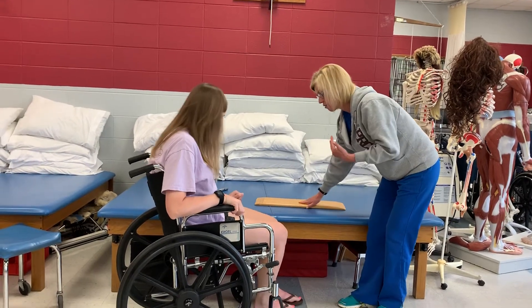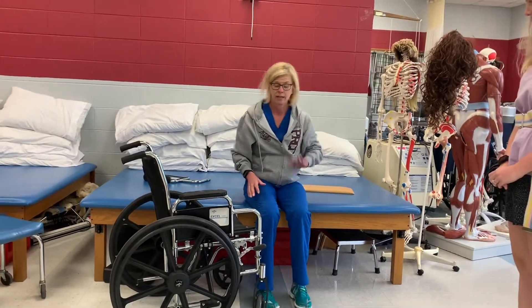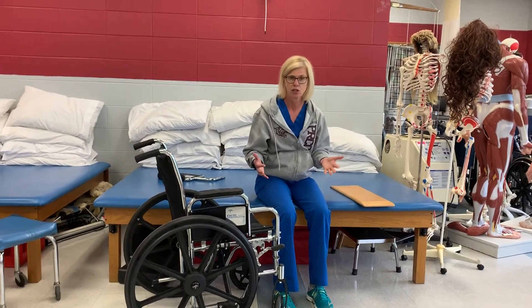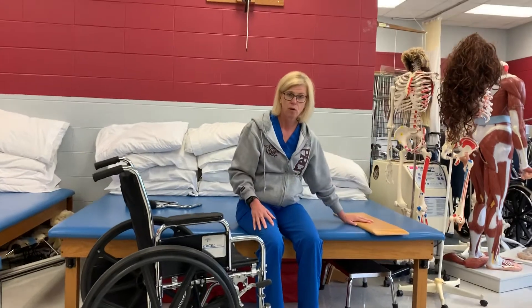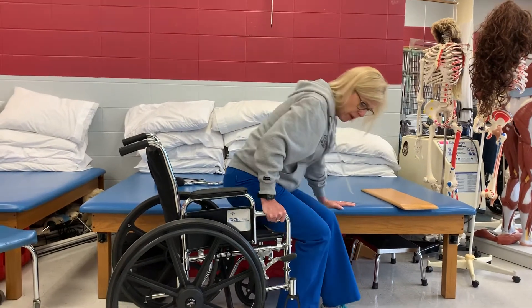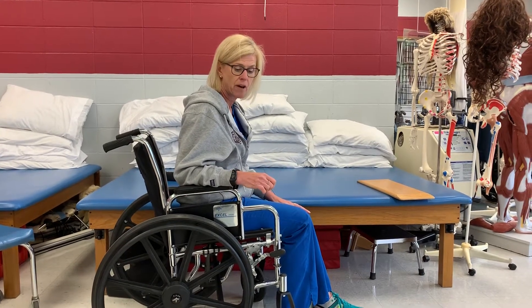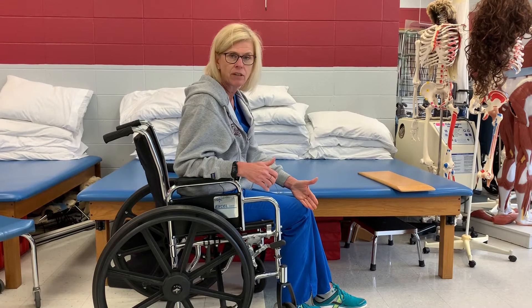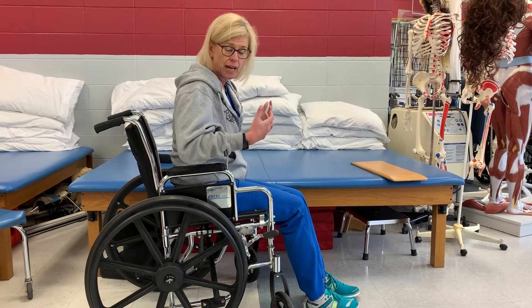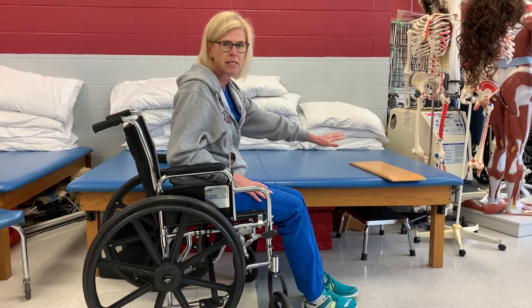Let me show you one other thing. When patients get really good — especially patients with spinal cord injuries who are always on the go and are never going to be able to do a normal transfer — you can take the transfer board away and just have them do a push-up transfer. That's where they're just pushing up and lifting using all arms with no legs involved. Patients with paraplegia at like T11, where their legs are involved, are usually very strong in their upper extremities and would just do a push-up transfer. That is a progression from a sliding board transfer.